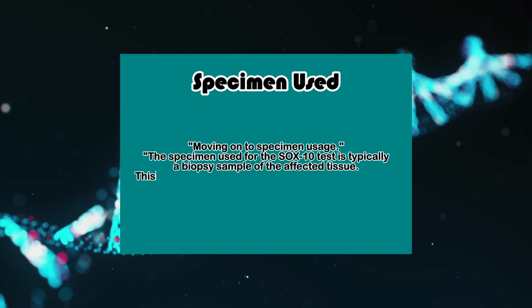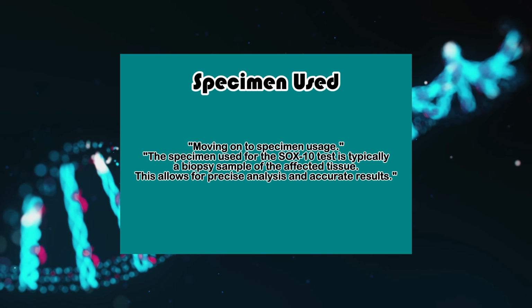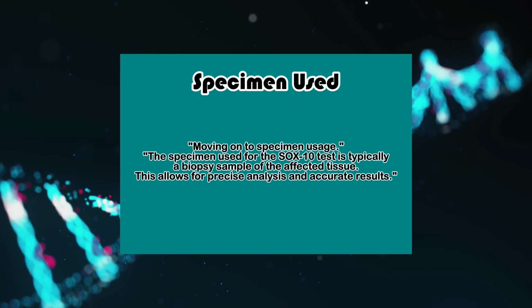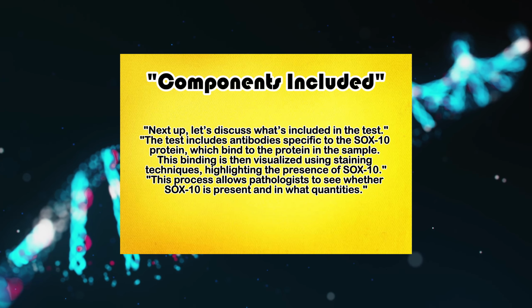Specimen used. Moving on to specimen usage. The specimen used for the SOX-10 test is typically a biopsy sample of the affected tissue. This allows for precise analysis and accurate results. Components included. Next up, let's discuss what's included in the test.